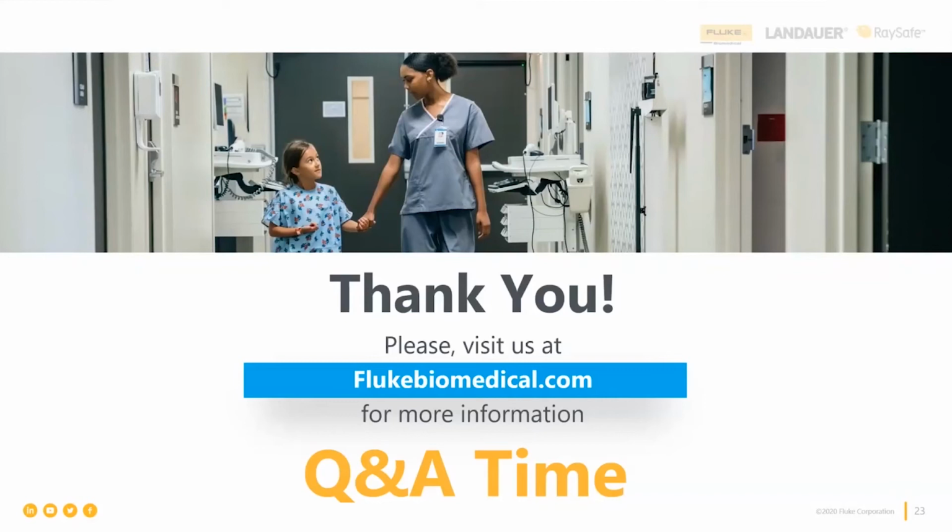Inside the defibrillator, we have electronics that carry current, so there are conductors inside, correct? Then we have the plastic. The plastic is an insulator, right? Not a conductor. And then what we're doing is we're creating the other conductive surface on the other side. So we have conductor, insulator, conductor. That describes a capacitor, does it not?